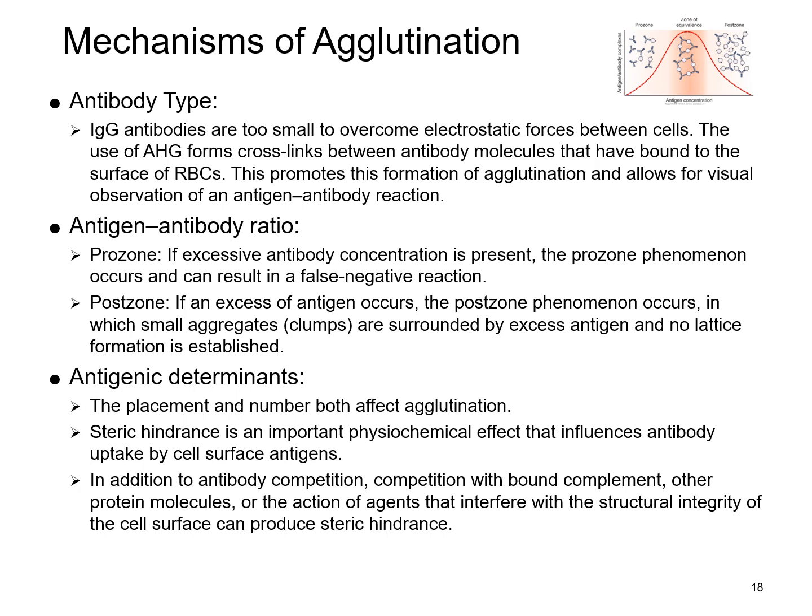Now, another thing that we have to note is the antigen-antibody ratio. Ultimately, we want it pretty equal, the amount of antigen binding sites as well as the antibody that's available, in order to have that reaction take place at what we call a zone of equivalence. So that's basically almost 50-50. You've got enough antigen and enough antibody to create that reaction.